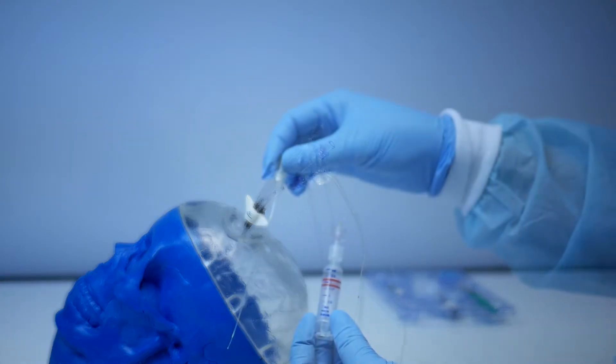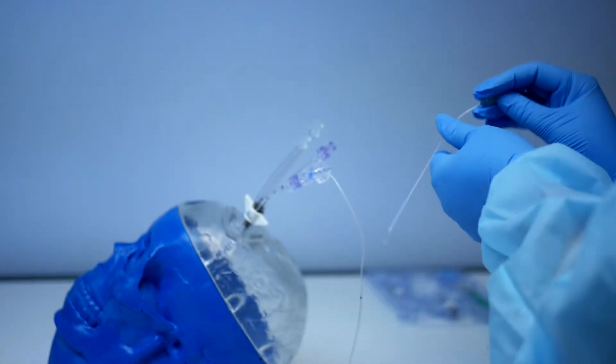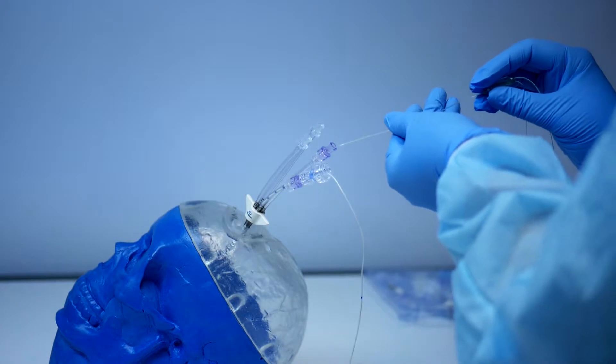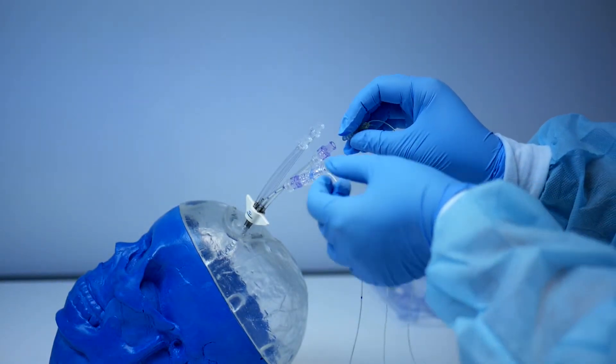Take the microdialysis sensor and insert it into the introducer that you just inserted into the mid-length pigtail. Secure the lure lock connection by turning clockwise.